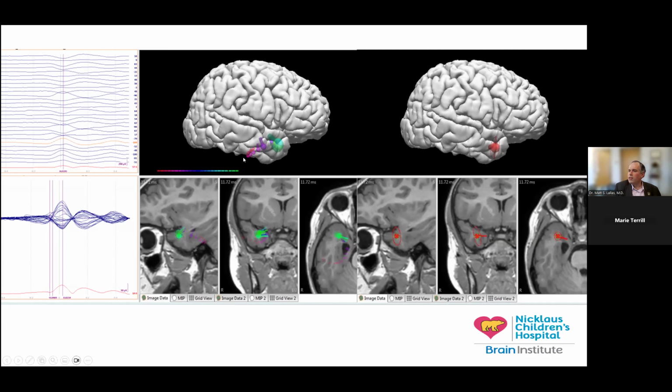And that allows us to get an idea of really how the current that is being predicted is moving around. Of course, the earlier in the spike that we are towards the baseline, maybe the more noise is contributing, and the higher we are, maybe the more the propagation effect. But this gives us sort of a visual representation of that too.